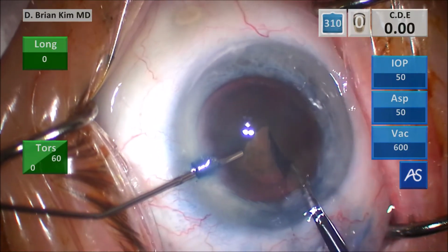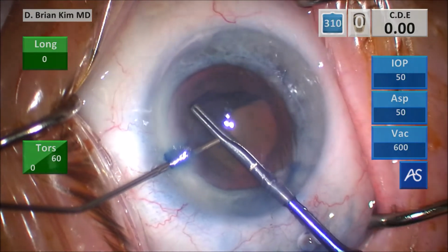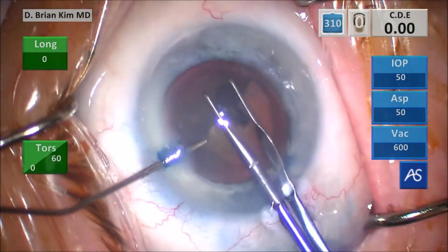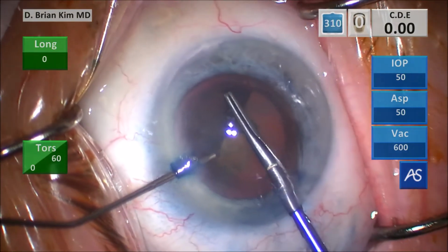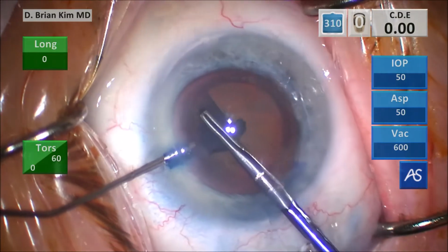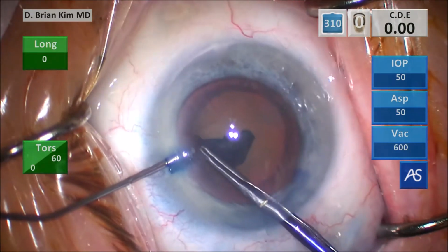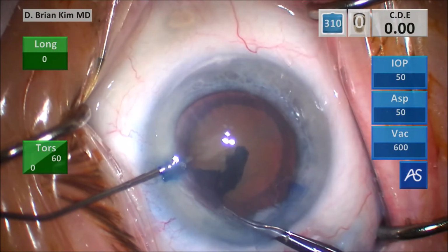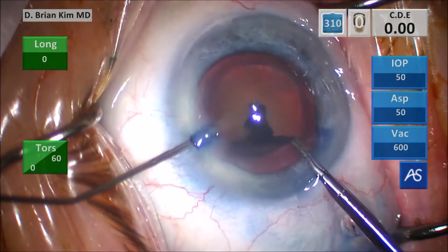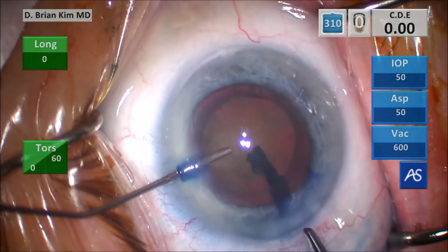So I puncture the center, create a nice tear pointing and pulling down, grabbing the right side of the tear, going around circumferentially, and I have great control, two-point fixation with the cannula and the rhexis forceps. And again, if I feel like I'm going to get a run out, I can push some more viscoelastic simultaneously. Finish off the rhexis, burp some viscoelastic out.